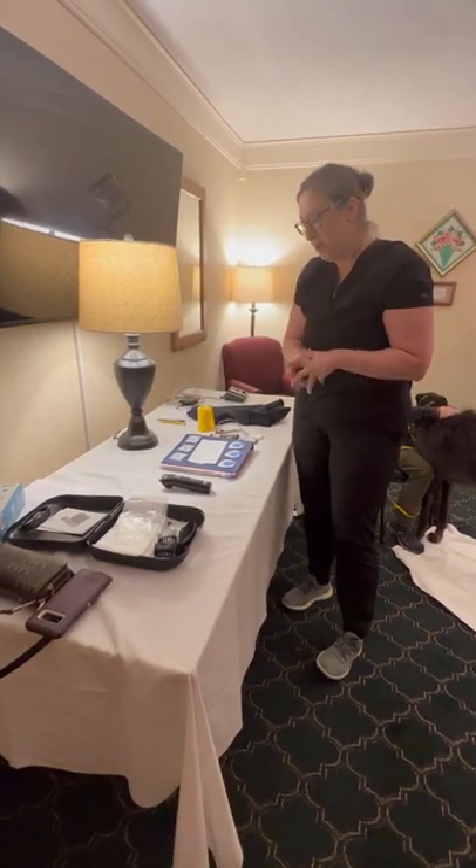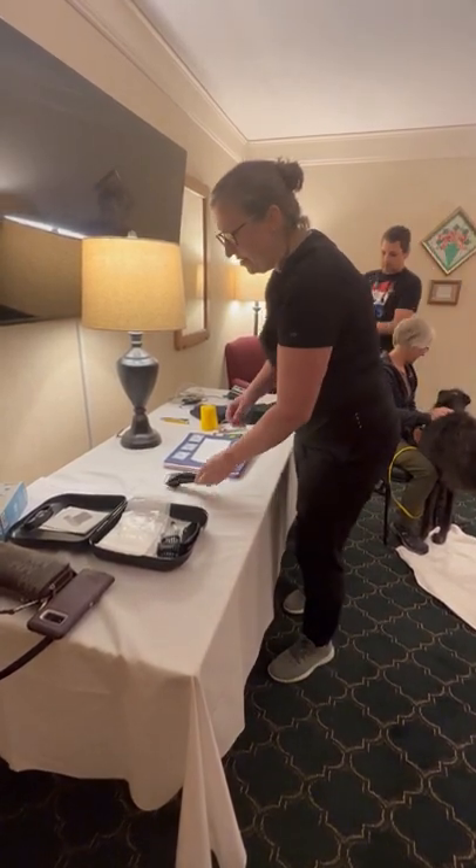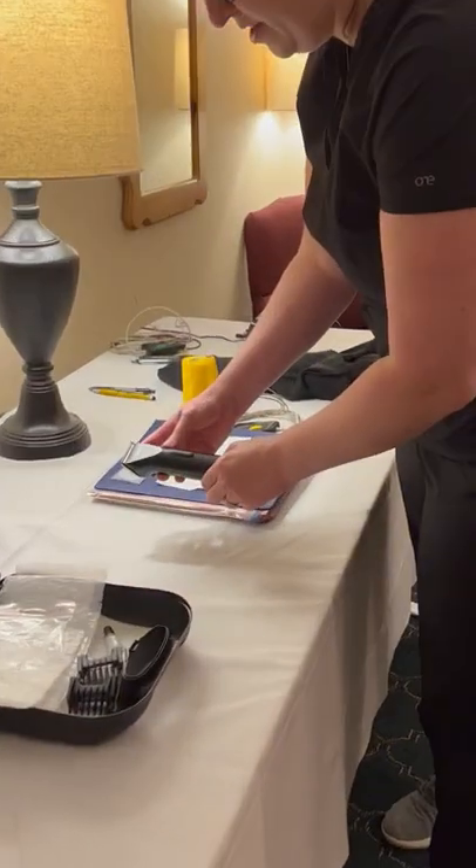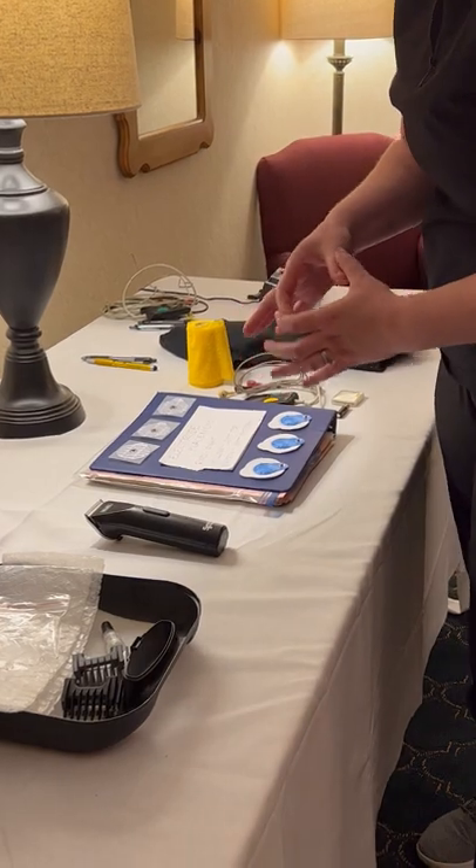This is a three-lead Holter system. The things that you'll need: you'll need a set of clippers. This has a 40 blade clipper on it. We'll be making three small patches of shaved fur.